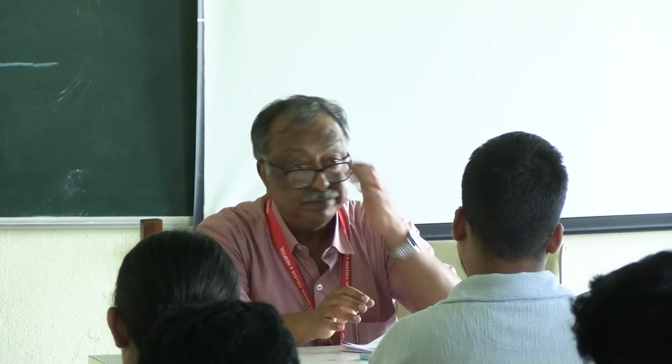Now, what is the common test we are doing for the assessment of hearing? Assessment of the hearing. First, from the very old days, is traditional screening. Traditional screening, what are we doing? Watch test.